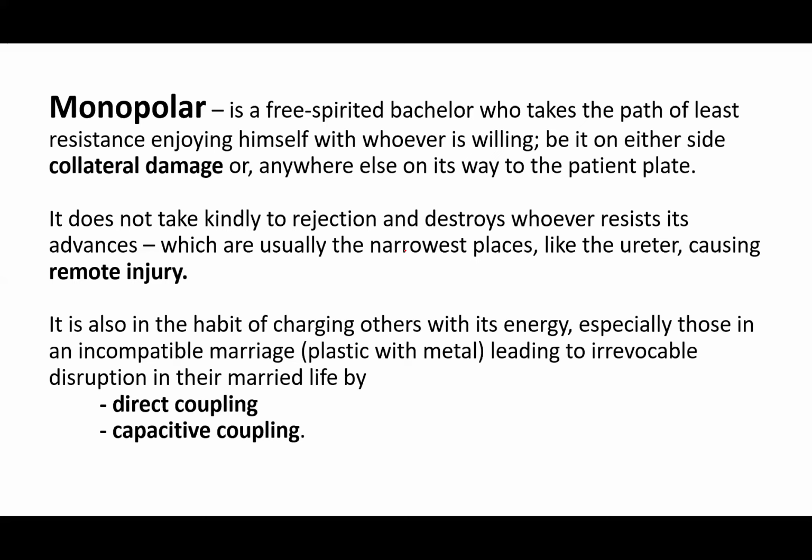It does not take kindly to rejection and destroys whosoever resists its advances, which are usually the narrowest places, okay, like the ureter. So you can see when you are operating around the pelvis, you can easily cause ureteric injury, okay, which might even be remote from what you are operating. It's also in the habit of charging others with its energy.